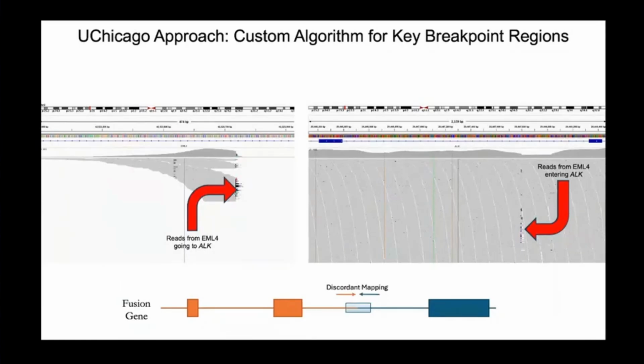The downside is it has a propensity for noisy false positive calls, but that's okay for 2 reasons. First, the regions that we're looking at are small, so the number of false results is generally low. And generally, it's the same easily recognizable noise repeatedly in many samples. So we actually are able to get rid of most of it up front. Second, I'd rather be aware of every possible finding.